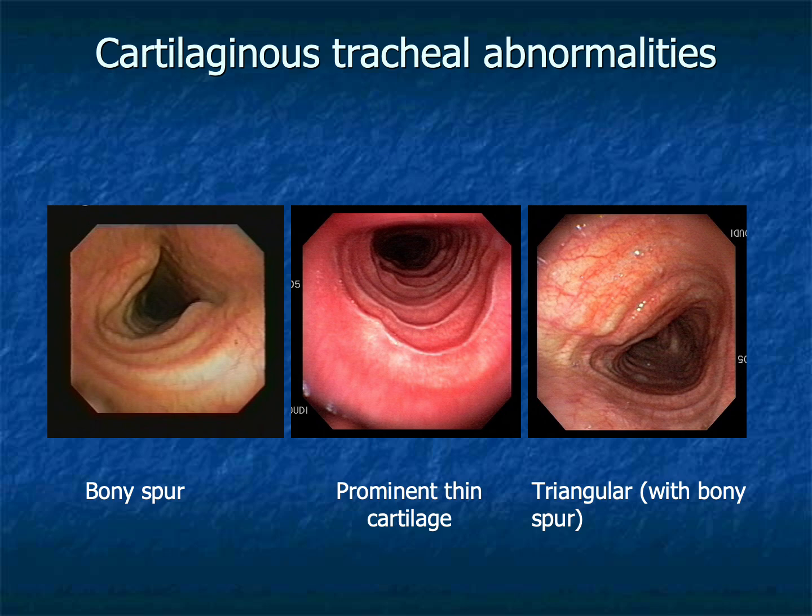Not all protrusions within the tracheal lumen represent disease. Prominent cartilaginous rings, bony spurs, and unusual airway configuration may be encountered as benign anatomic variations. These findings should be recognized and distinguished from infiltrative lesions, tumors, or inflammatory abnormalities. The bronchoscopist should develop familiarity with normal variants in order to avoid over-interpreting benign findings.